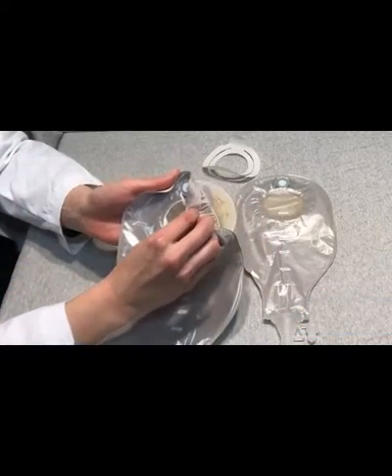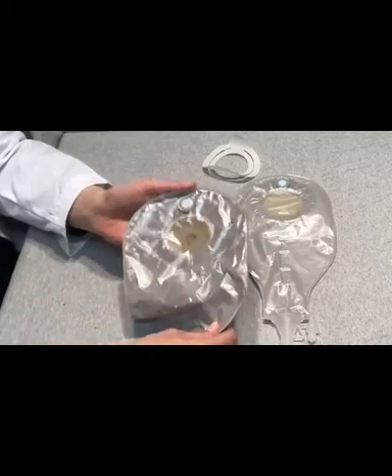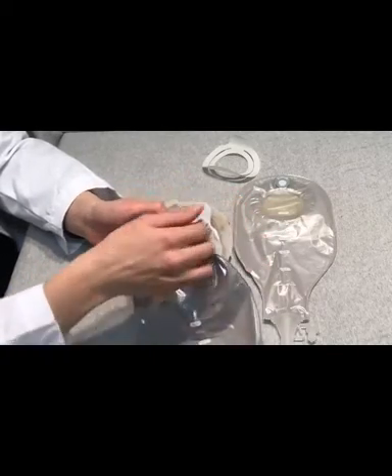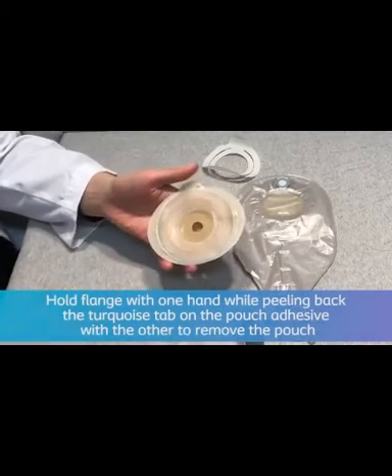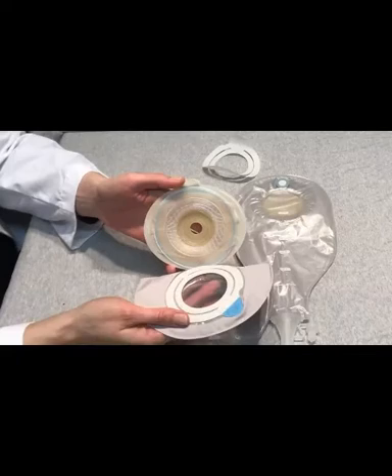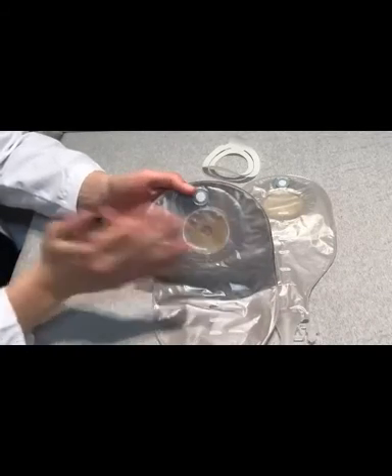You want to make sure that you have a good seal all the way around. And you can also give it a good tug to make sure it's on there. And if you need to readjust, you can. You just pull in this blue tab. You can peel it off. Again, nice and clean and dry. Line up the bottom to the line on the bottom, and you can apply this way.